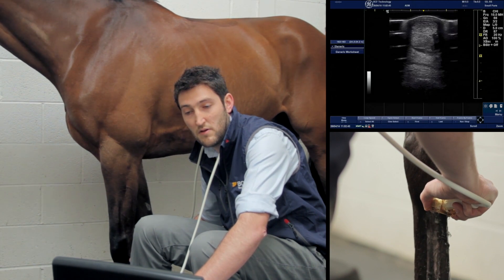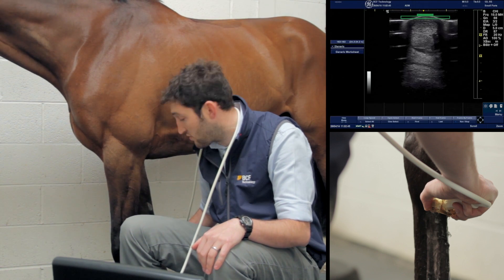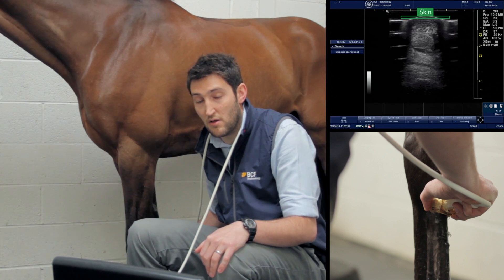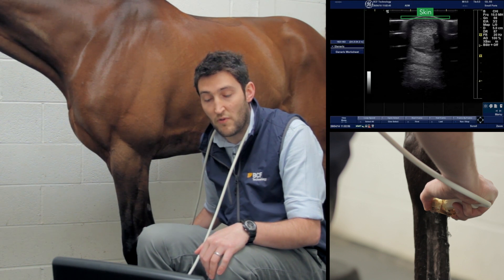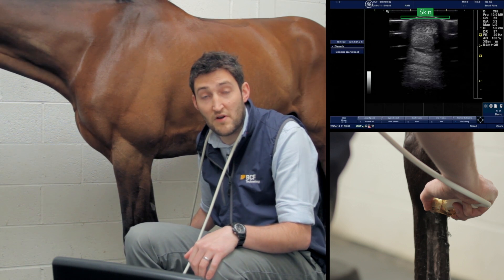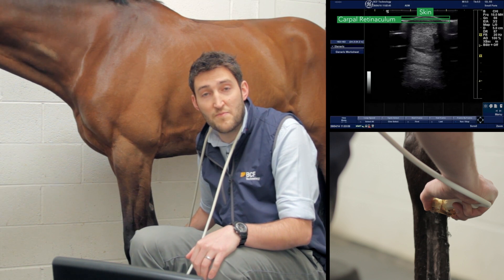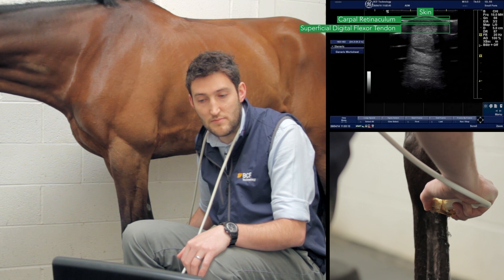Once we have our picture, we freeze it and look at the anatomy. At the top of the screen, just under the skin, we're keeping the probe with the lateral to the left of the screen, equating to lateral on the leg. We have the skin, then a very thin band constituting the remains of the carpal retinaculum or flexor retinaculum.